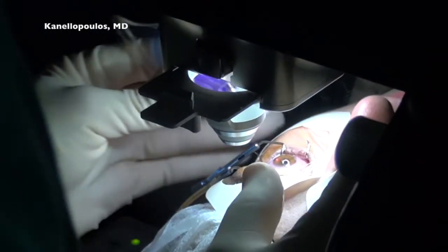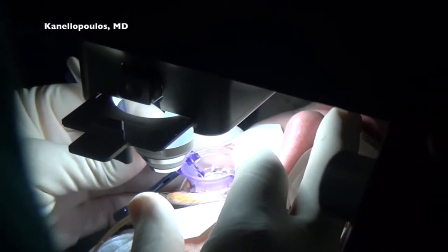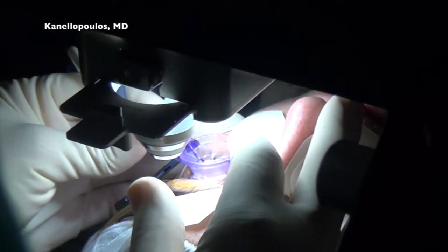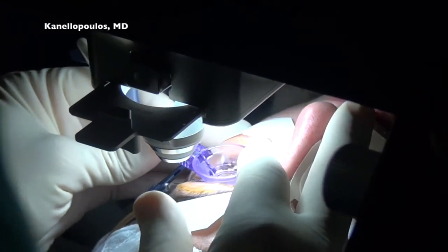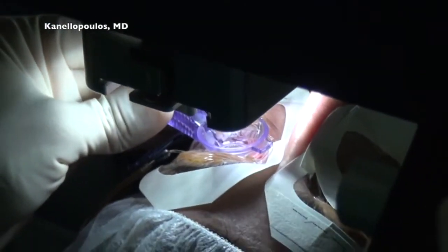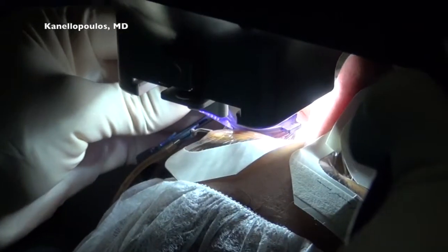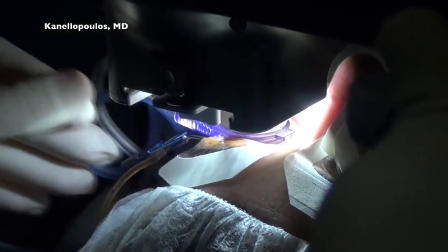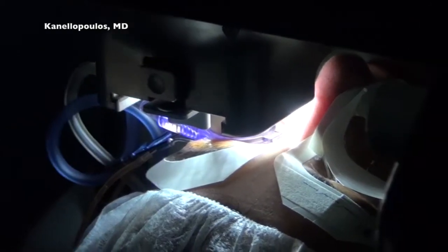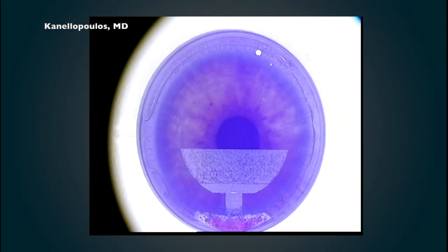One important point that I omitted to mention, we're seeing how I'm engaging the suction ring in the left eye. Sometimes in order to avoid having the nose of the patient come very near the FS200 apparatus, we'll tilt the patient's head away from that. So in this case, we would have tilted the patient's head towards the right and thus give a better field for the left eye, and vice versa for the right eye. Tilt the head towards the left and give a better, uninterrupted field for the femtosecond laser.